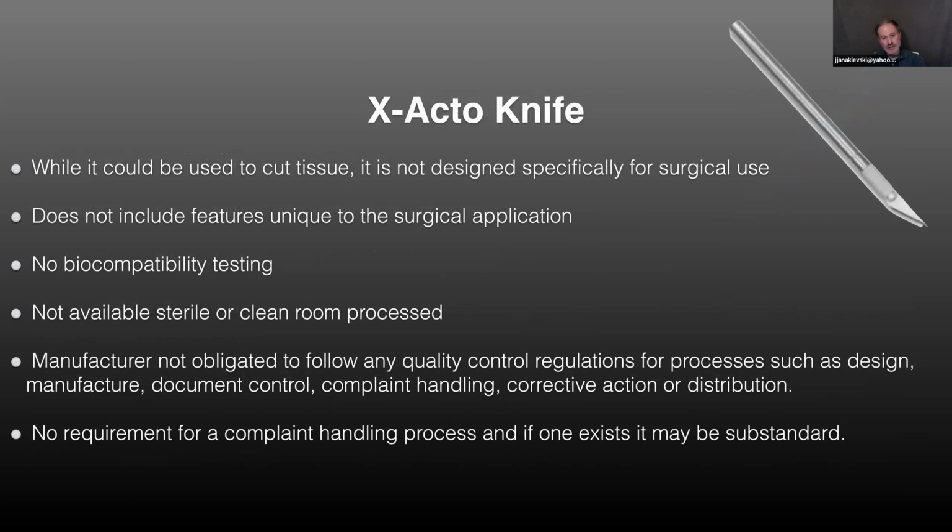It's not necessary to be packaged in a clean room or maintain a certain level of manufacturing, such as the examples I gave you with the plumber's tape, with the residual solvents and the impurities that are left on it. And the manufacturer is not required to have a quality control system in place to manage the challenges or complaints that could arise from their product, because it's not designed to be used for medical purposes.